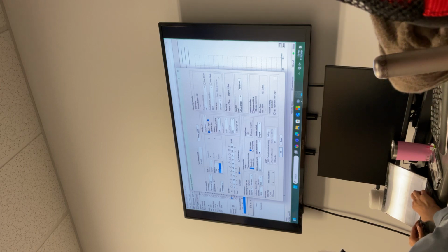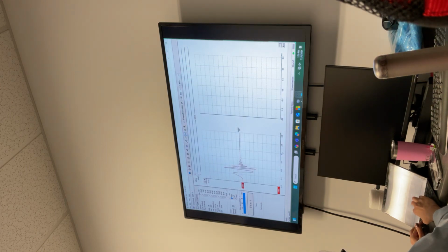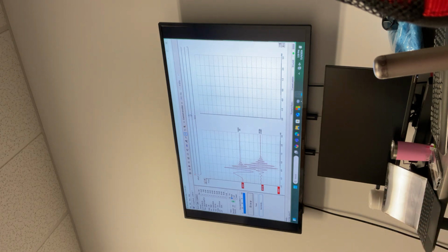Let's look at 4000 hertz. So you can see this, if you see any of this in the EEG recording, that means you're picking up a lot of stimulus artifact, you need to be careful. You see this? So this is 4000 hertz. Let's go to 2000.